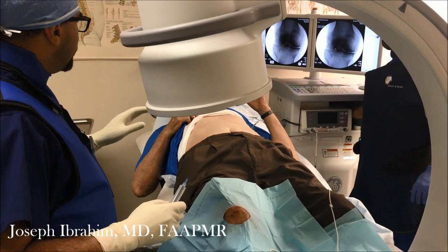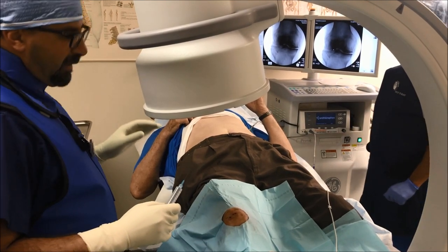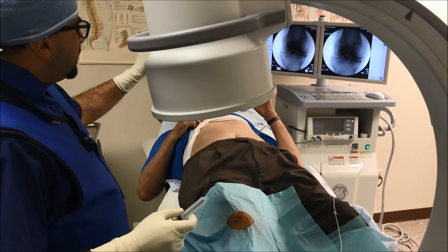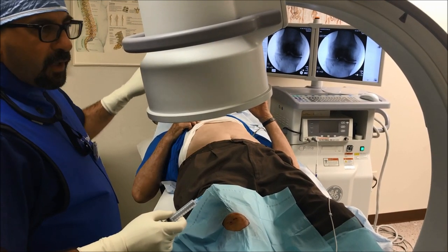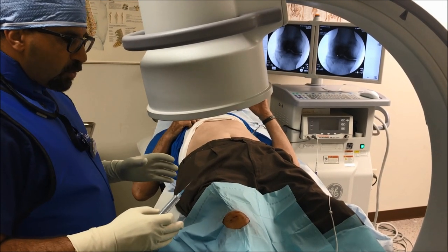Do you agree that we're recording this procedure? Okay, very good. If we look at the screen, this is a very arthritic knee — it's bone-on-bone — and what we are doing is called genicular nerve ablation.